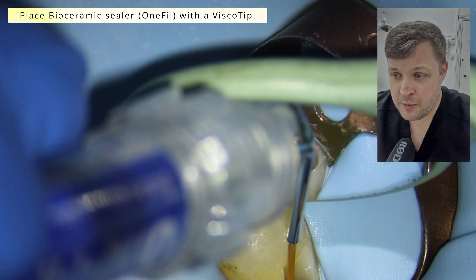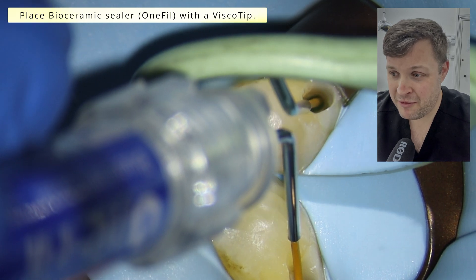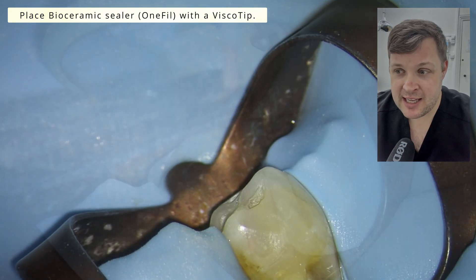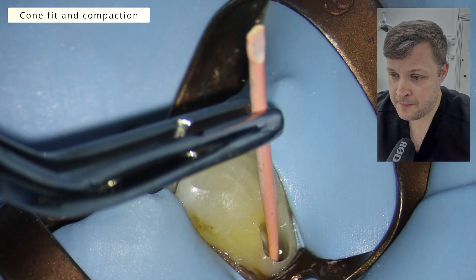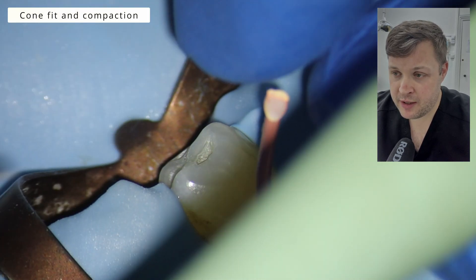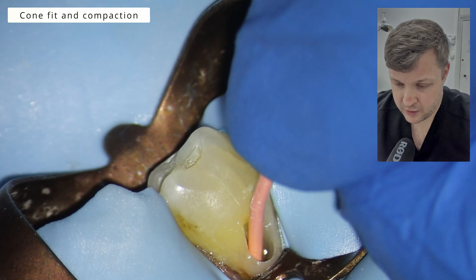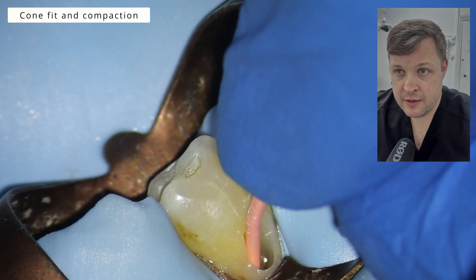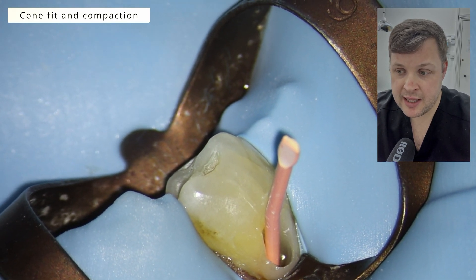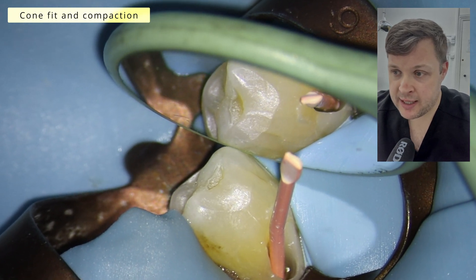Now we're going to obturate. As with most things, I'm using One-Fill — this is a bioceramic sealer with absolutely fantastic Visco tips. What I like to do is fill the coronal to mid third with the bioceramic sealer and very, very gently push the GP point to length.